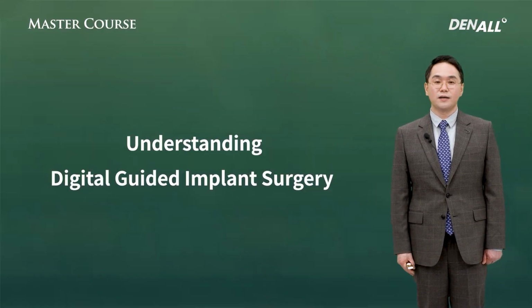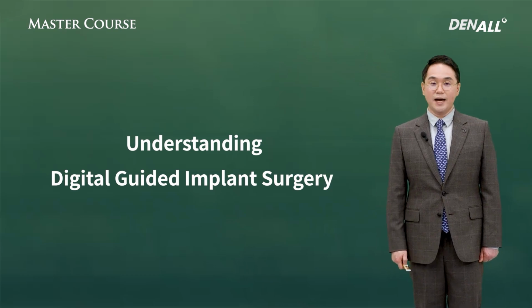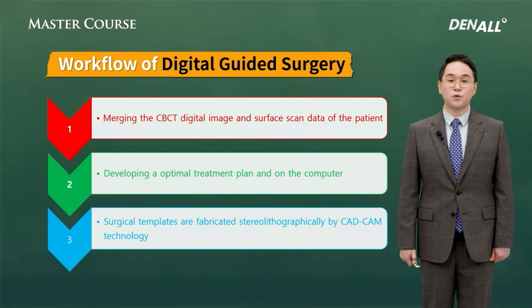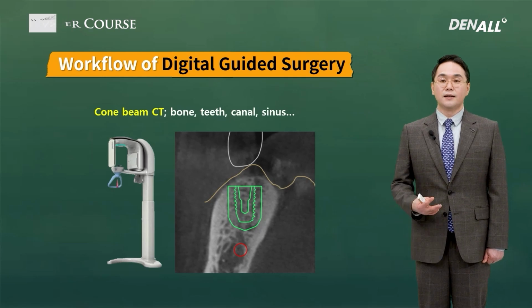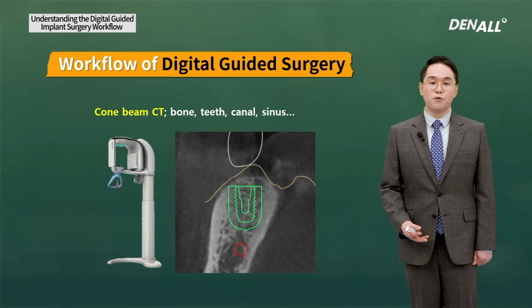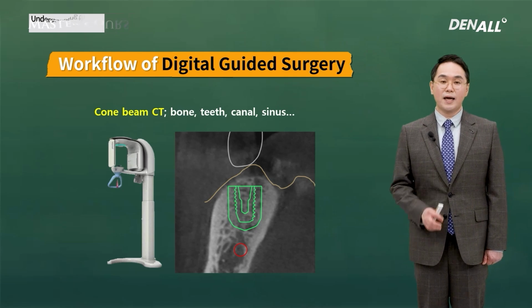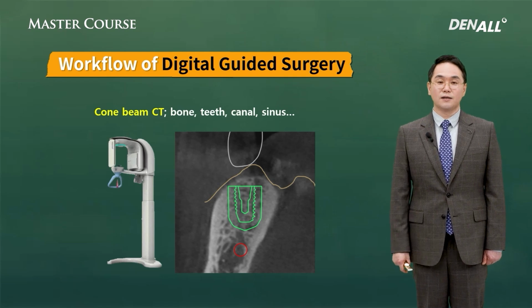In order to do guided surgery properly, we need to understand the guided surgery principles and workflow. The workflow is as follows. Let's have a look at it in more detail. The first step is to take the cone beam CT. By taking the CT, we get the three-dimensional information about bone, teeth, mandibular canal, and the distance to the sinus.